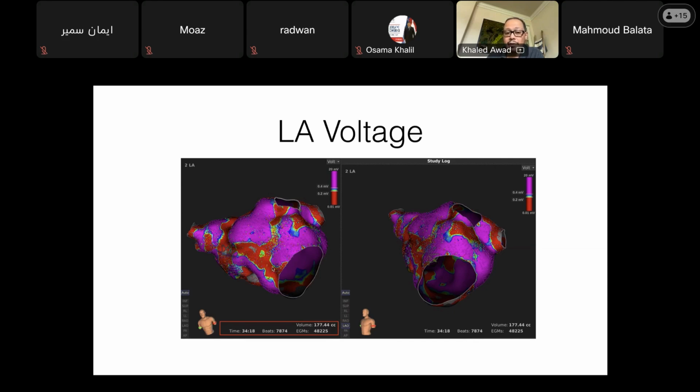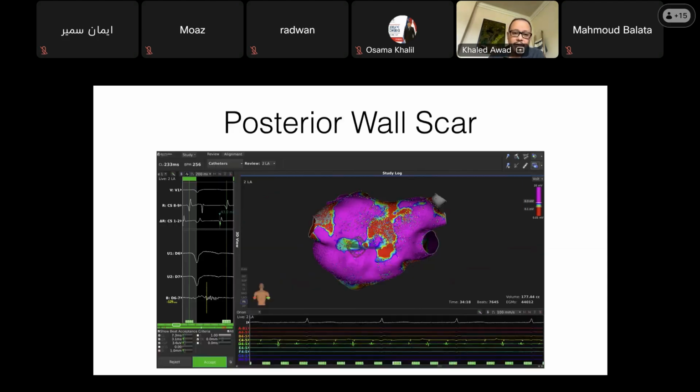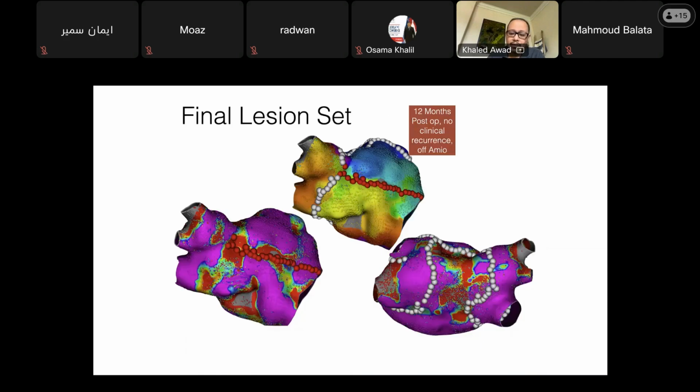Now they're going to start looking like proximal to distal activation in the coronary sinus because they will spin that way. They'll spin through scar and go down. So what we ended up doing for this patient, and he had some posterior wall scar too, you can see that here, is we made a line that goes through the region of scar, okay? Because that's the problem.